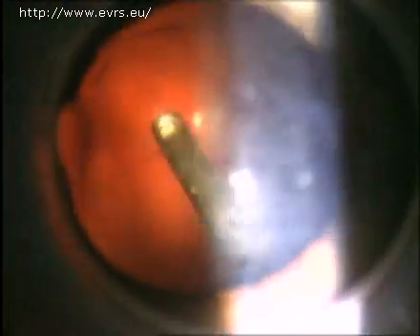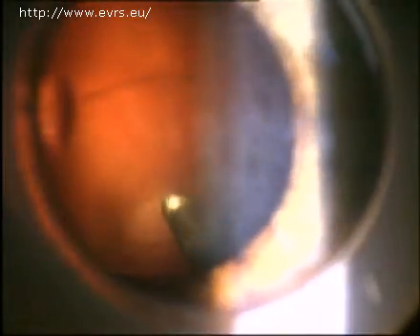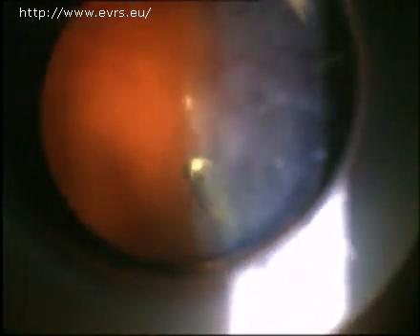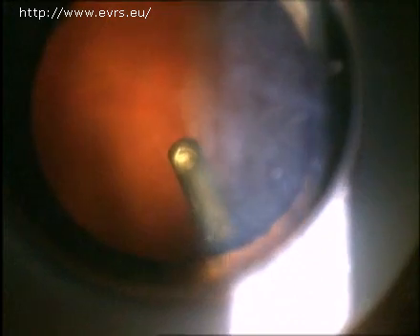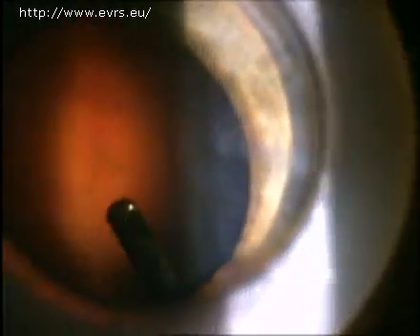Then, since we want to remove the anterior hyaloid without risking the aspiration of the posterior capsule, we drop the cutting frequency and the aspiration flow to 8 cc per minute. Here, the hyaloid is aspirated. Going back in the central vitreous, one will want to raise the flow level to 15 cc per minute before starting the peripheral vitrectomy.